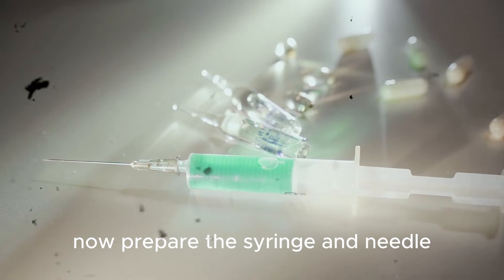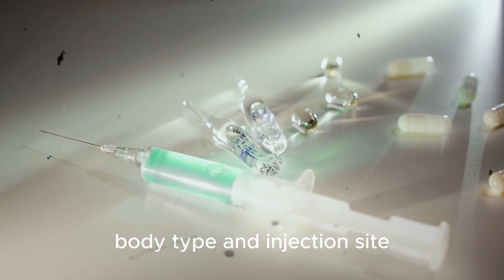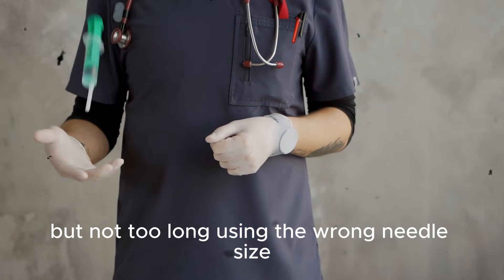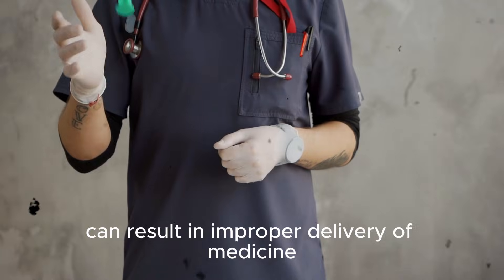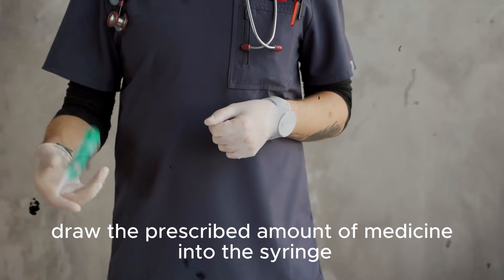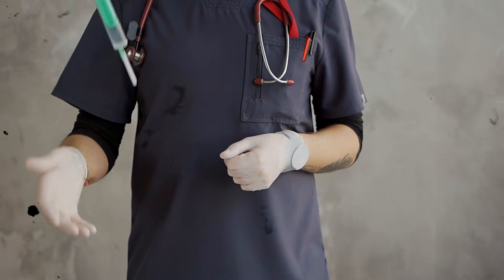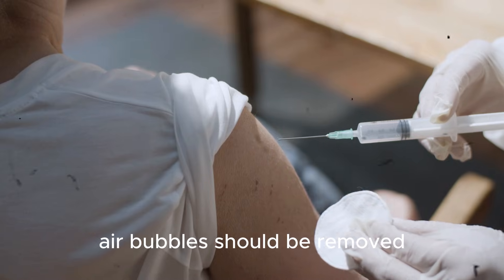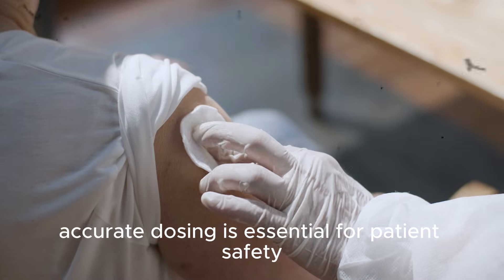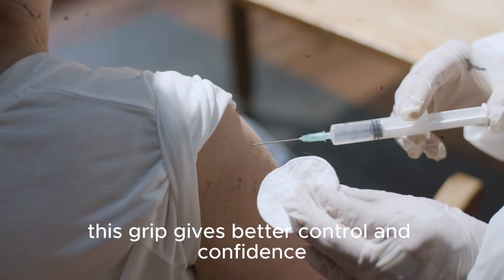Now prepare the syringe and needle. Select the appropriate needle size based on the patient's body type and injection site — the needle must be long enough to reach the muscle, but not too long. Using the wrong needle size can result in improper delivery of medicine. Open the syringe package carefully, ensuring sterility. Draw the prescribed amount of medicine into the syringe by inserting the needle into the vial and pulling back the plunger to the required dose. Check the syringe for air bubbles; remove them by gently tapping the syringe and pushing the plunger slightly. Accurate dosing is essential for patient safety.